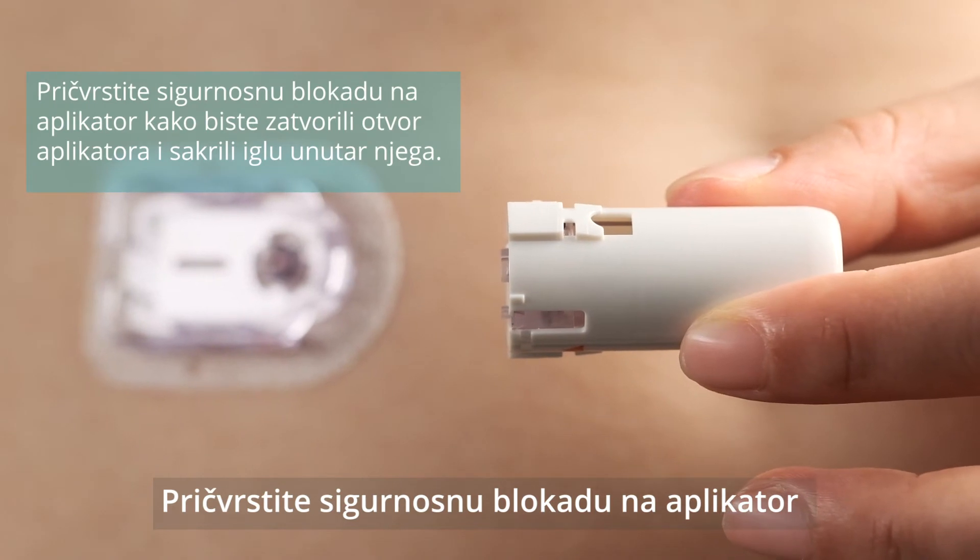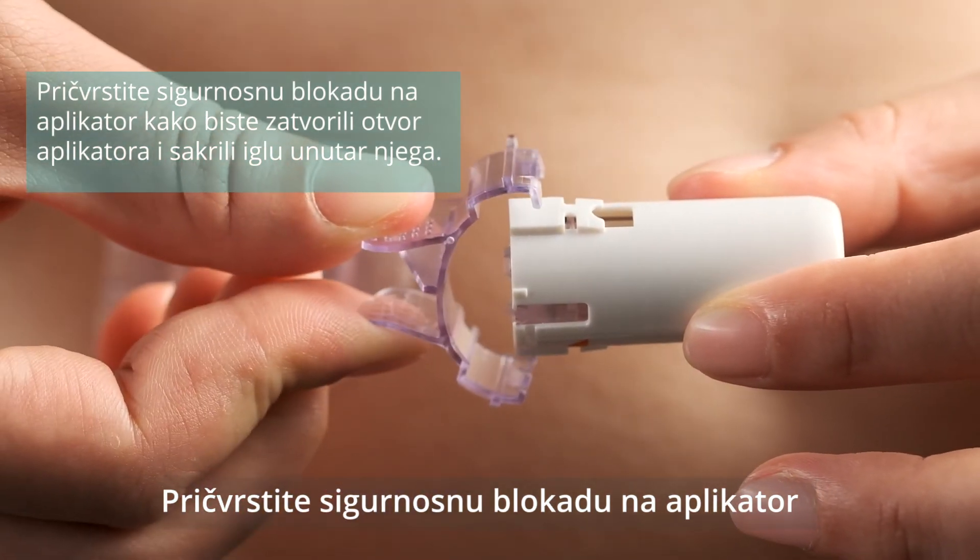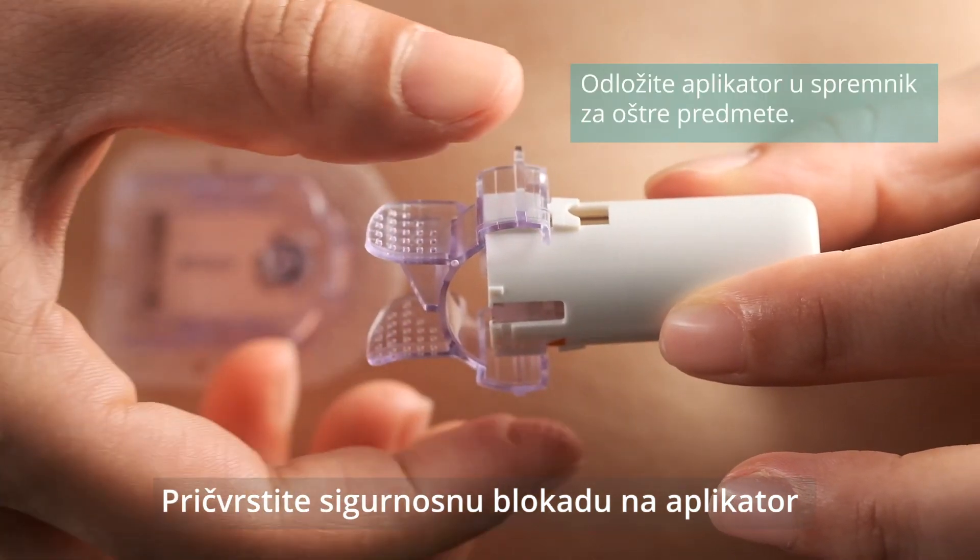Attach the safety lock on the inserter to cover its opening and conceal the needle inside. Discard the inserter into a sharps container.